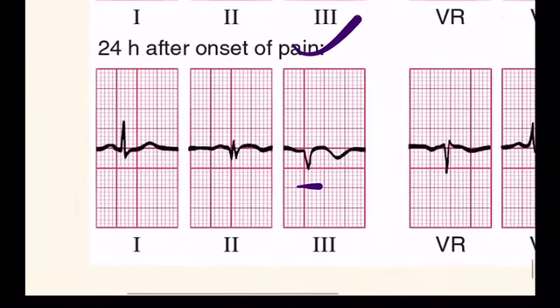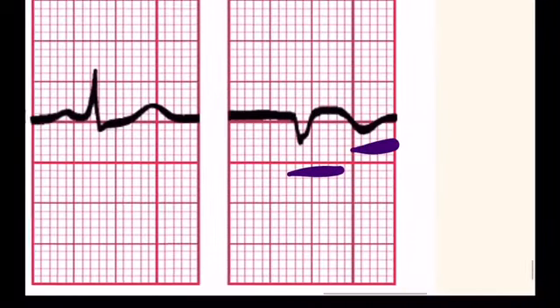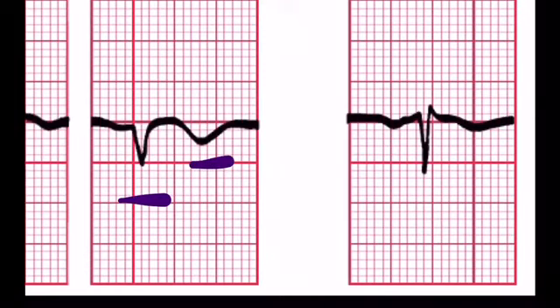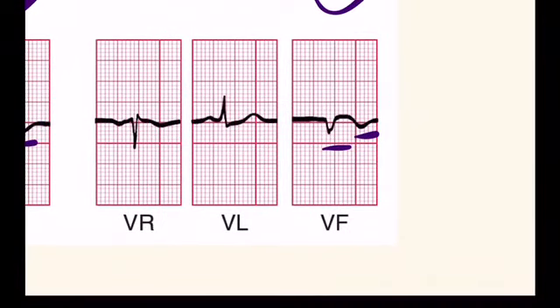Now see lead 3 and lead VF. Can you appreciate the inverted T wave here? This inverted T wave, this Q wave, in lead 3 and VF.